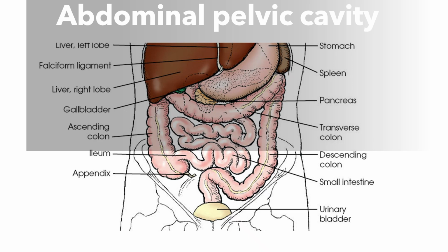But the illustration is just showing you an anterior view of the major abdominal organs, and this illustration is to roughly match up with the radiograph that we're going to look at later. Now, some things will just not show up. Some things show up pretty good, some things not so much. So what does and doesn't show up?